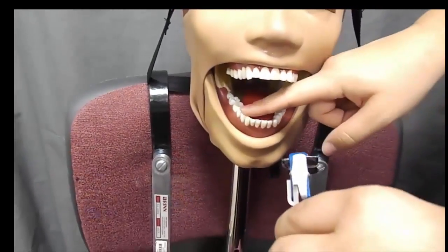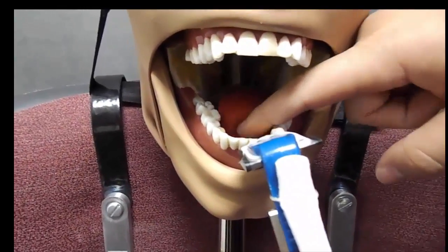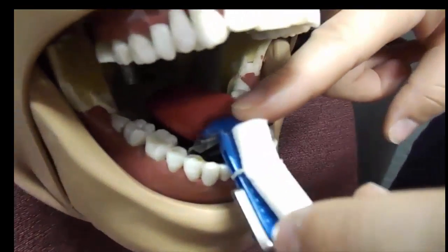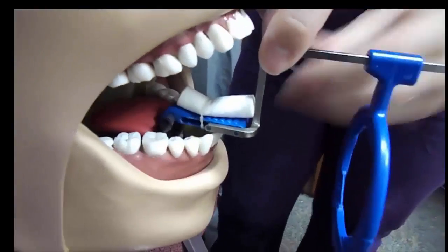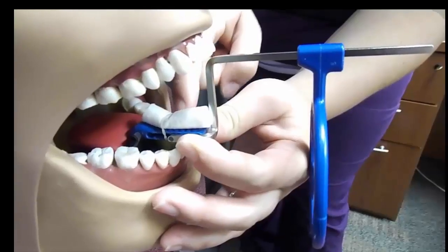When placing this instrument, always go in through the front of the patient's mouth, never the side. Use your bite block to push that tongue back, or move Dexter's tongue out of the way, and push the bite block back till the incisal edge of the teeth of interest are resting at the end of the bite block.